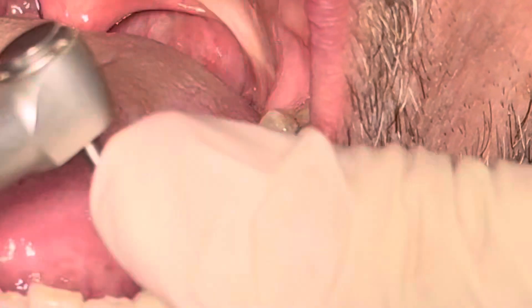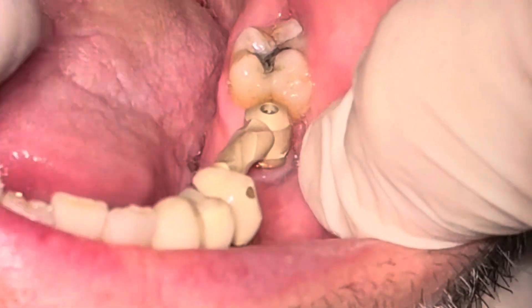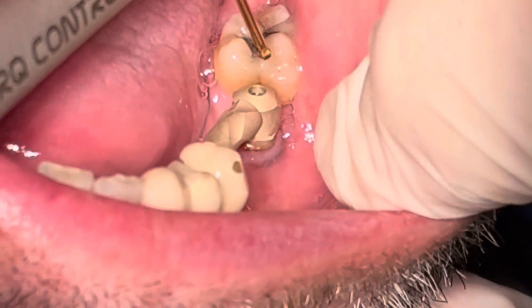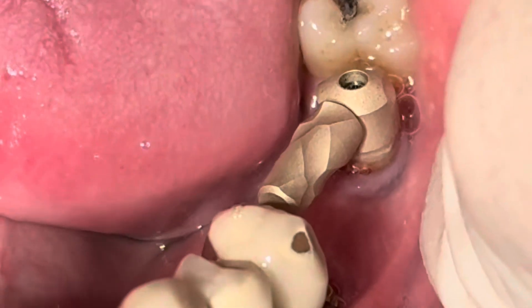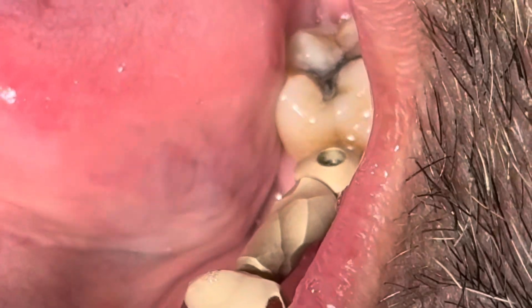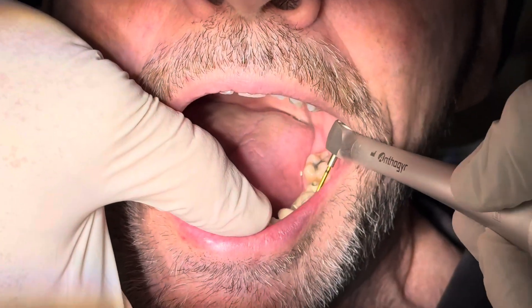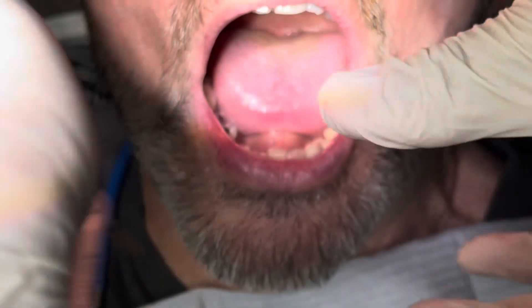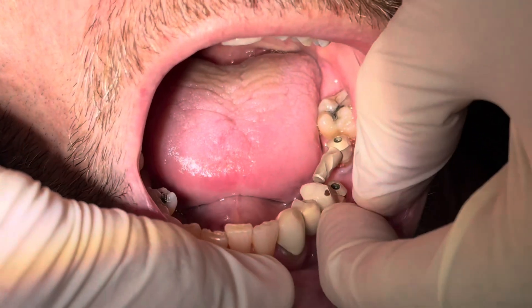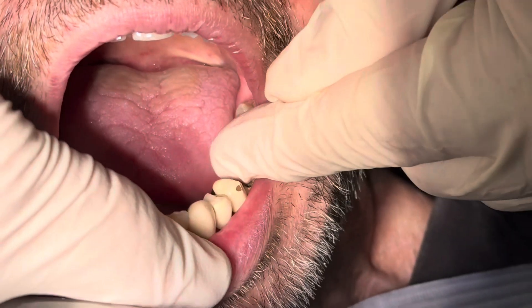Using the torque control wrench, you're going to hold the polo down, get it into position, line it up, and do the final tightening. I tightened them to 10 Newton-centimeters in this case, which is slightly below the 15 that's normal for screws. They have to be secure enough to not move around during scanning, as any movement would throw off the data.